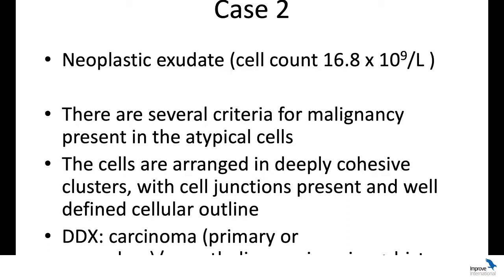And when it is a carcinoma, it's impossible to say if that's a primary, so because this was thorax, this would be a lung carcinoma, or it would be a metastatic carcinoma. So, for example, this could have well been metastatic mammary carcinoma, okay? So we need the imaging and the history to be able to tell us more and to differentiate more. But we are able to say that we've got a malignant neoplastic population in our thorax, so immediately our prognosis, we know that it's not going to be good for this animal, unfortunately.